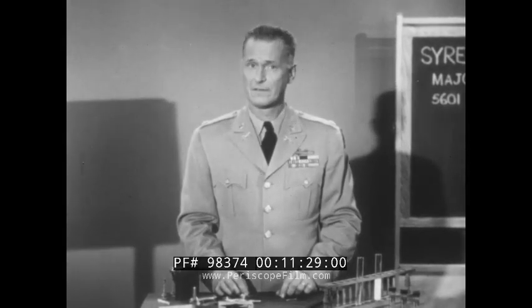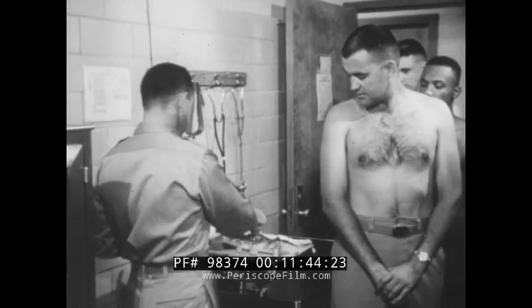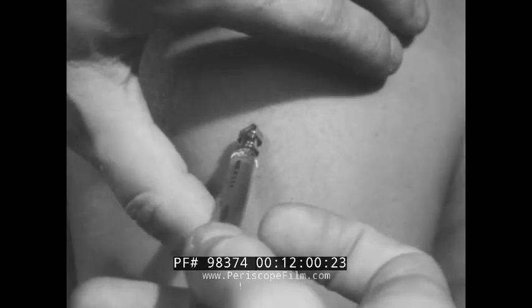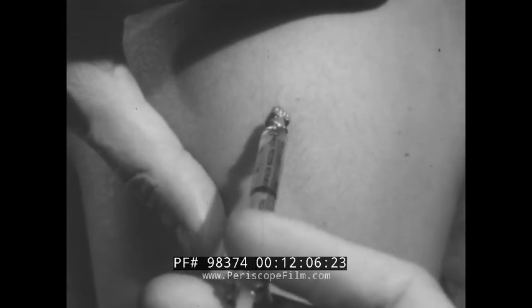A lot of people have a lot of wrong ideas about needles. Among the many protective mechanisms that nature has built into all of us, there's a strong dislike of sticking sharp objects into our skin. This is normal and natural, and that is why there are classes for you on the proper technique of injecting the needle. One word of caution about injecting yourself: you've all had shots from the medics. Often they pinch up your skin to stick in the needle, and if they want to inject medicine into your muscle, they change the direction of the needle after it goes through the skin.